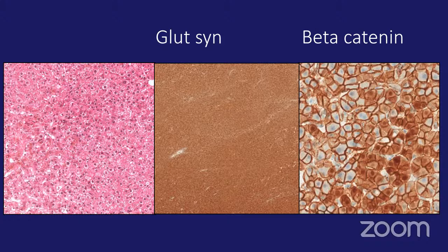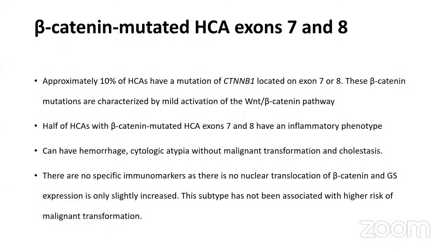Sometimes not all examples are this classic, and if they are less so, they can sometimes have very focal beta-catenin and patchy glutamine synthetase, and then that's when you would need molecular profiling to help you in diagnosis.